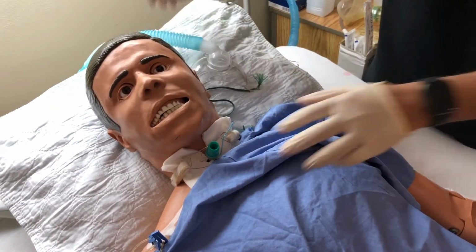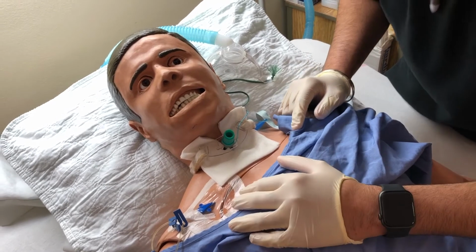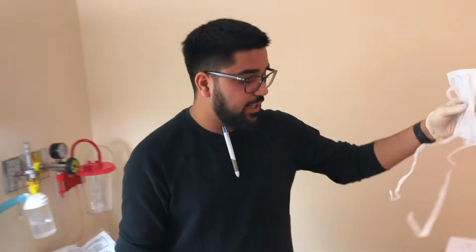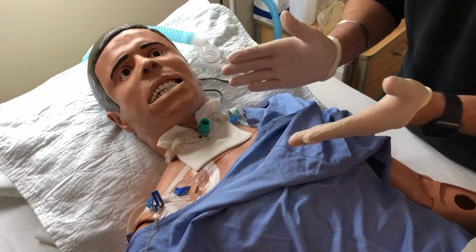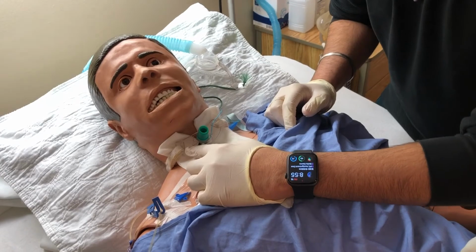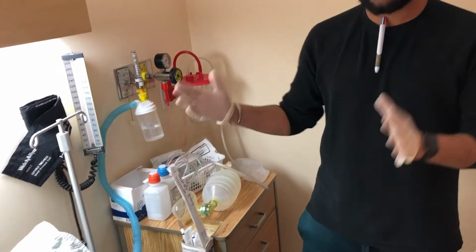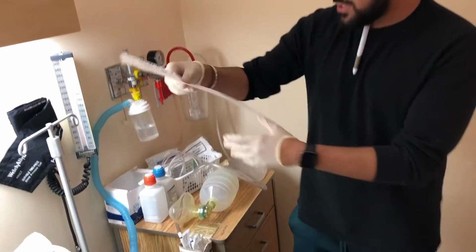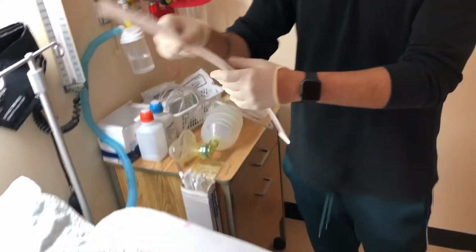We can put that here, and we can look at our cannula. We know that's dry and intact. I would also have a mask on for this. I have a mask here, but for demo purposes, I'm not going to put a mask on. But you don't want to get any of this contaminated. If you look there, it says 7. So the way we choose our catheter size is 7 minus 2, so 5 times 2, which is 10. So if you select this port right here, it's 10 French, which is the correct catheter size.